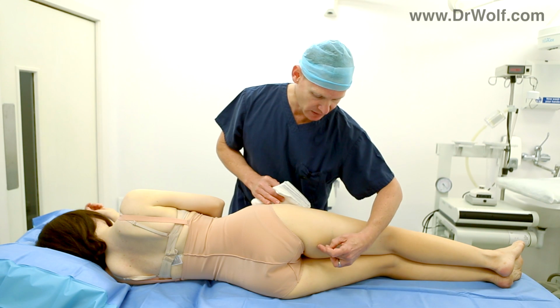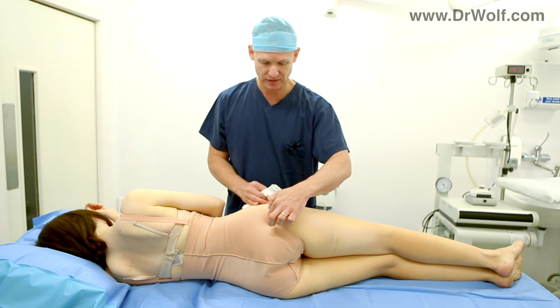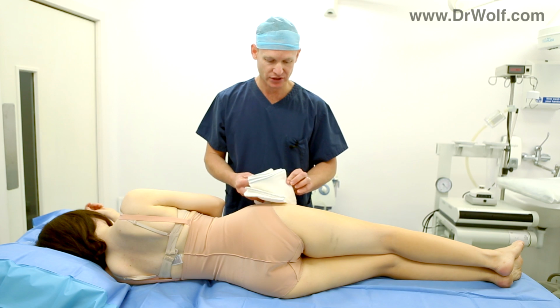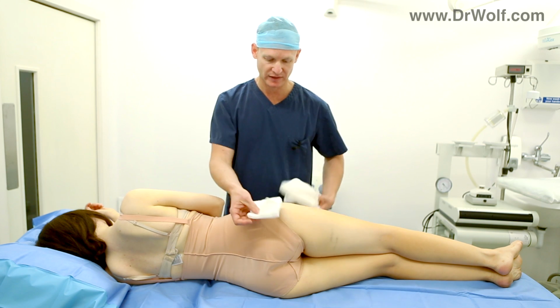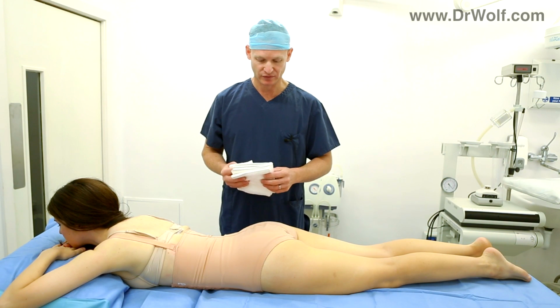I'm going to show you now the access points for outer thighs. Generally I'll place 1 in the buttocks crease, and then 1 in the underwear line just up here, and that allows me to treat this whole area here. The padding initially will be placed into these particular areas, and then again can be replaced by smaller pads of this size.